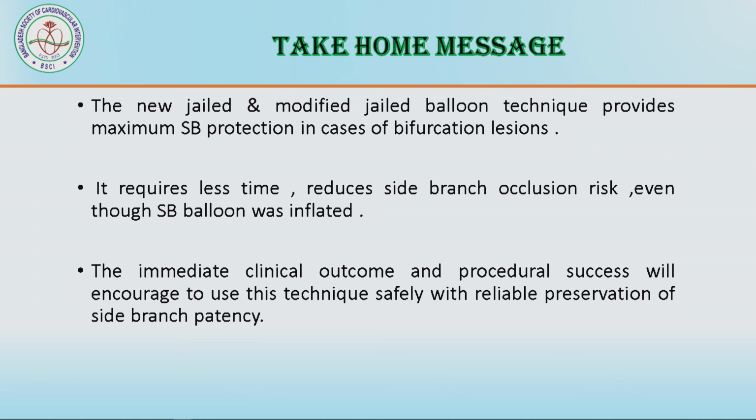So the take home message: the new jailed and modified jailed balloon technique provides maximum side branch protection in cases of bifurcation lesion. It requires less time, and reduces side branch occlusion risk, even though the side branch balloon was inflated. The immediate clinical outcome and procedural success will encourage use of the technique for safe and reliable preservation of side branch patency. So thank you.